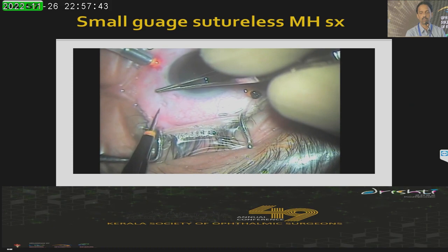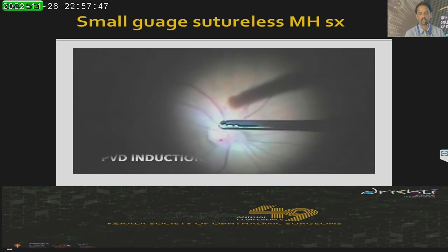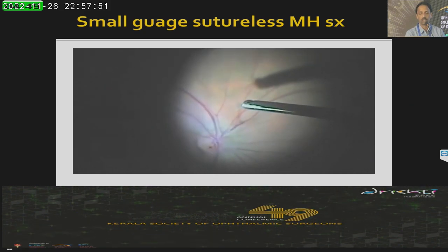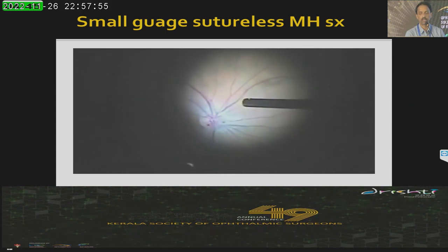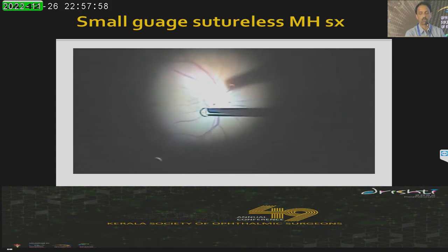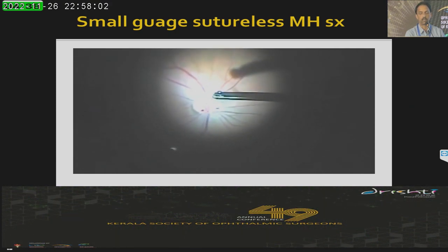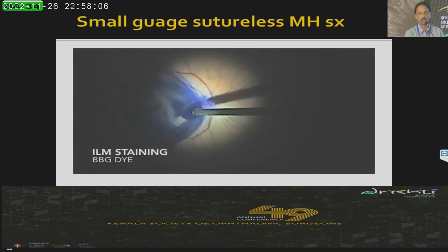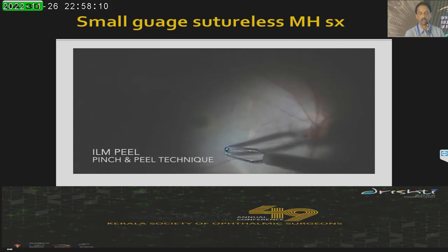Nowadays we do small-gauge surgery — 23 or 25 or 27 gauge vitrectomy. The crucial stage is PVD induction — it is a very important stage. I don't always use IVTA, but in certain situations I do when I think I haven't got a good Weiss ring. After PVD induction, we inject brilliant blue dye and then start our peeling. I use the ILM forceps to make that first defect on the ILM, then the flap is raised and propagated around the hole.